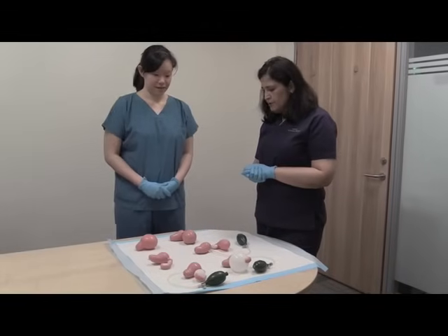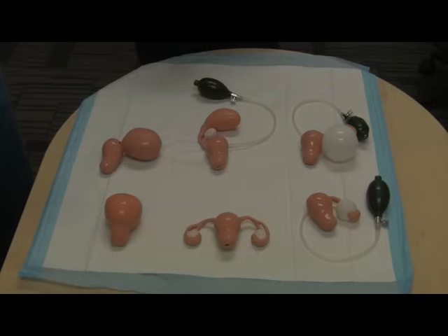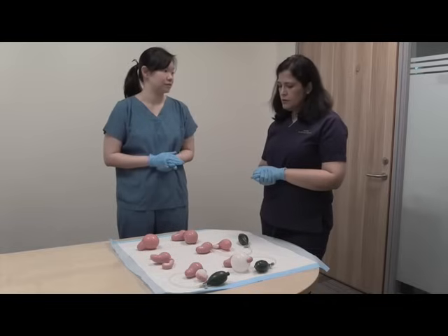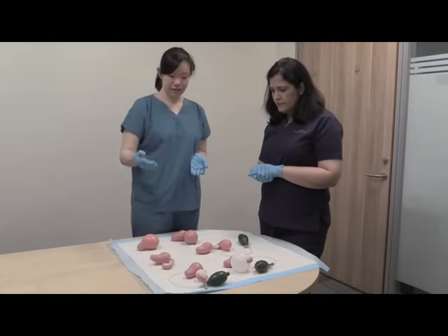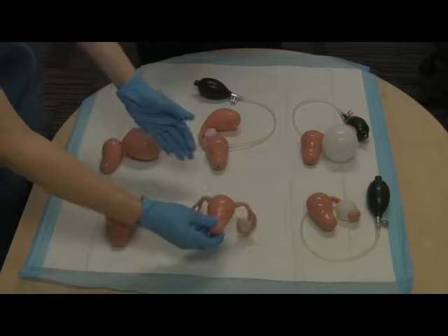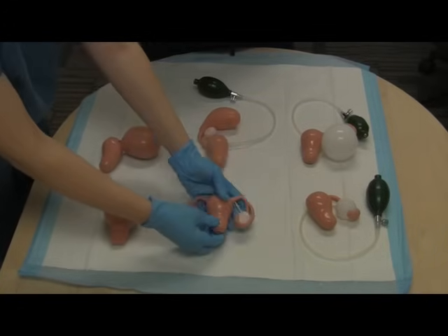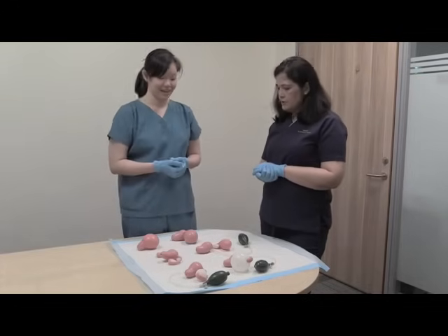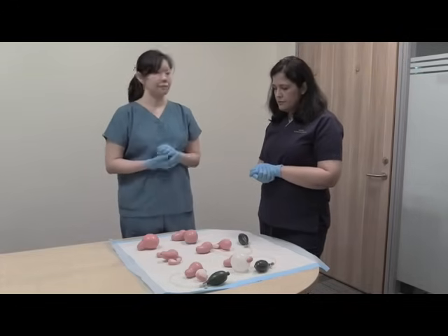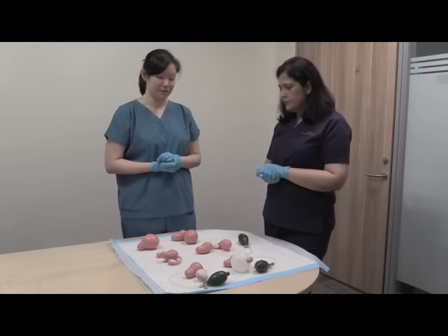So Cindy, what do we have here — what are all these models? As you can see, there are various models showing both the normal uterus as well as the uterus with pathology, and adnexa with pathology. In the center here we can see the normal uterus as well as the normal tubes and ovaries. This can be inserted into the pelvic trainer that we just practiced on, so we can actually feel it and practice before we even touch an actual patient — great for building confidence.